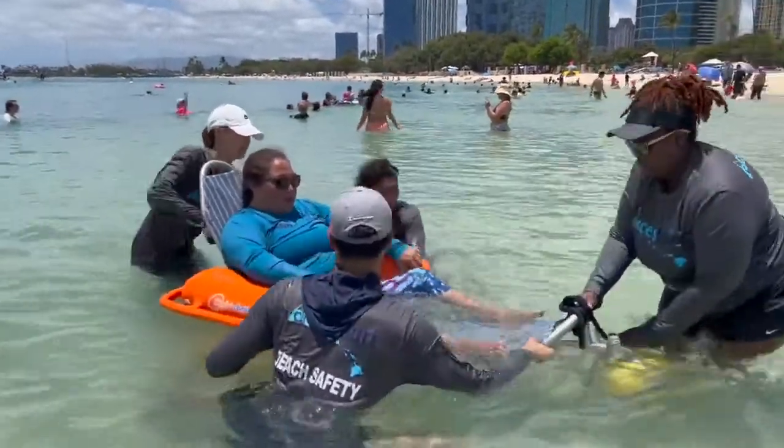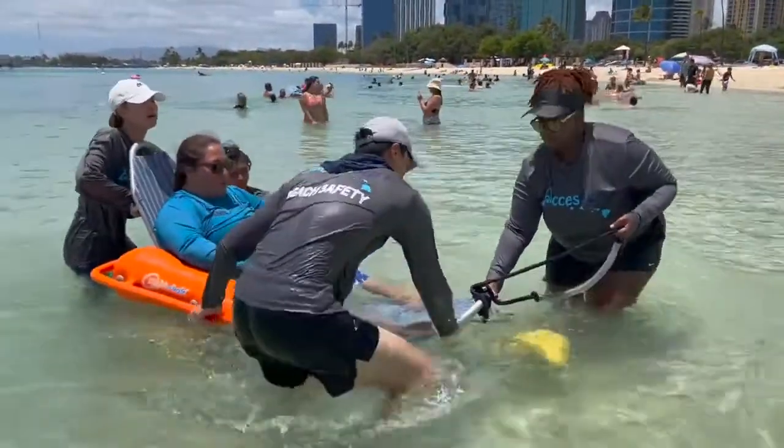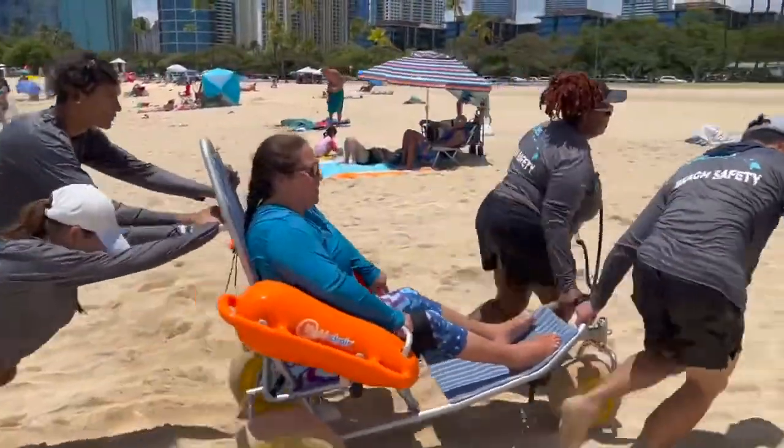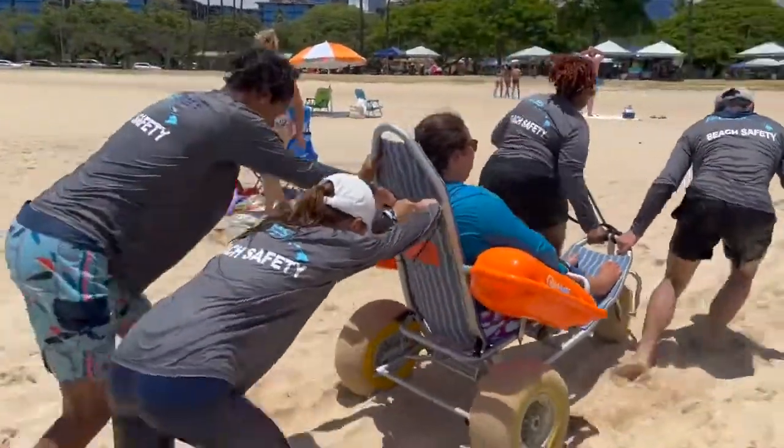Depending on the conditions, the entrance to and exit from the water should be timed between the waves. Lastly, all team members should work together to push the Mobi-chair out of the water and up the sand.